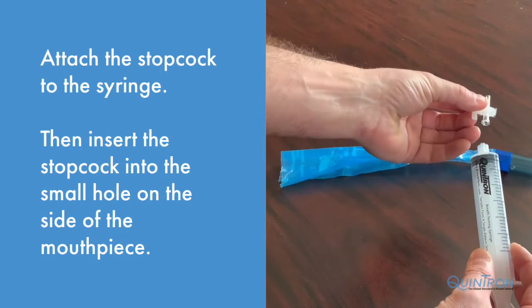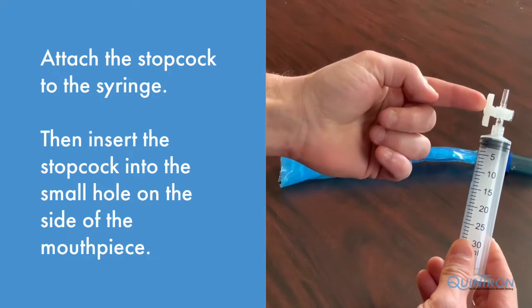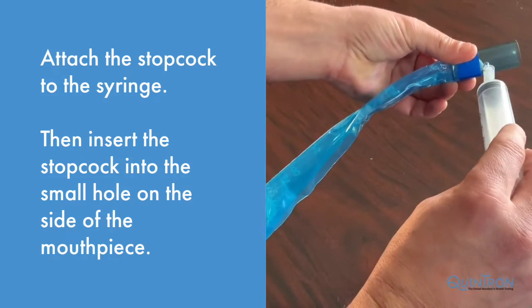Attach the stopcock to the lure lock end of the Quintron syringe. The stopcock should be in the open position. Insert the end of the stopcock into the small hole onto the mouthpiece.